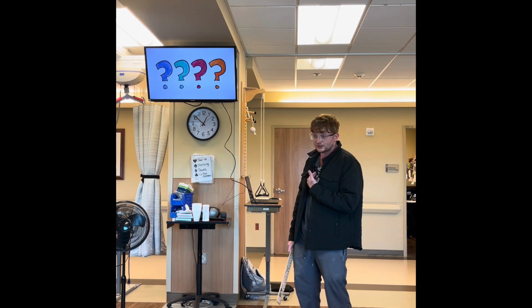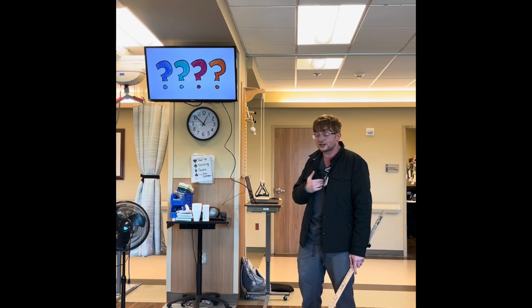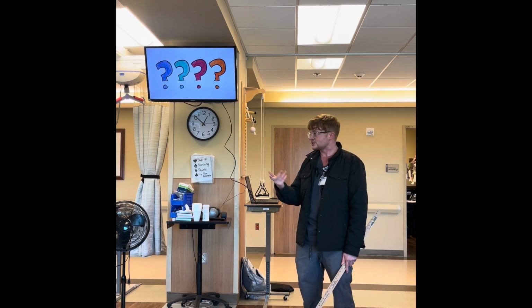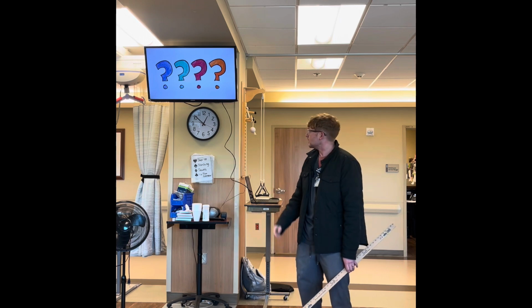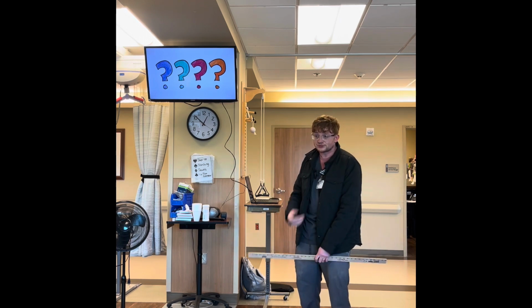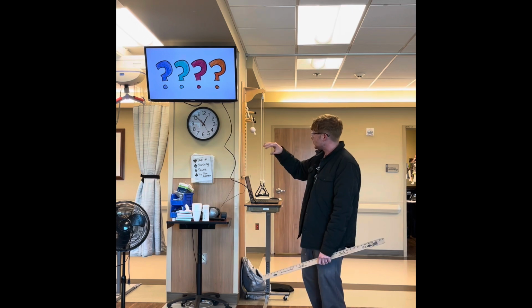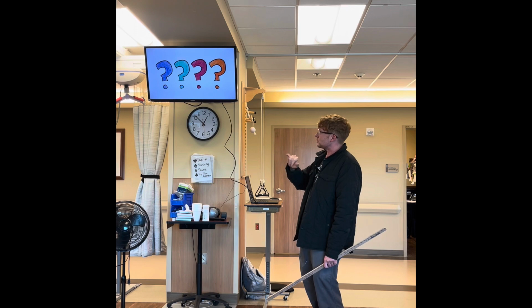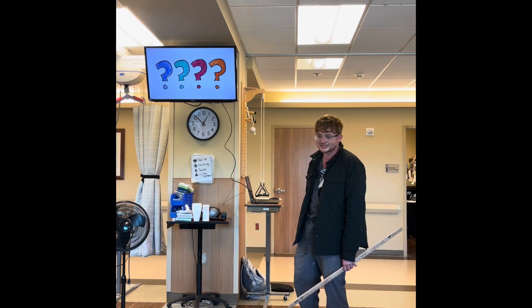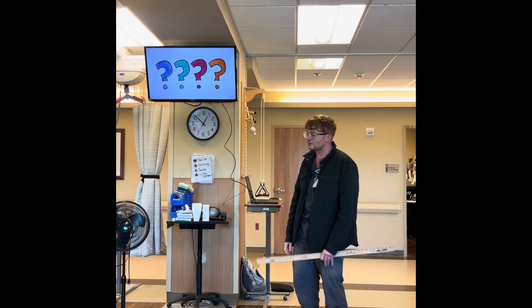Sometimes that's effective at clearing it, but oftentimes if it's very severe and they don't have the feeling, and it's even silent aspiration, which is just when there's no coughing and no patient response, it might fall on down. And at that point, that one little instant of aspiration, you kind of have to use your own clinical judgment of how far you want to push the exam. You don't want to keep filling it up, but you want to see what you need to see while you have them down there.